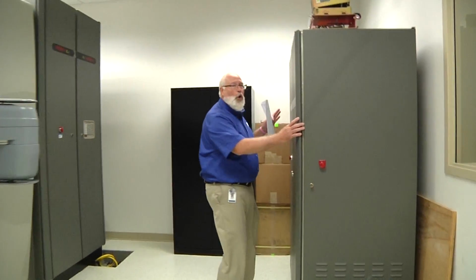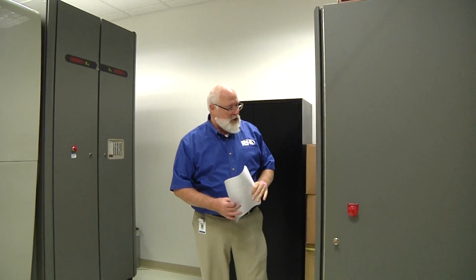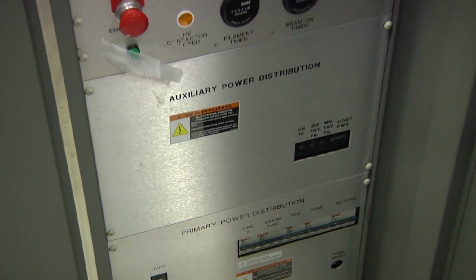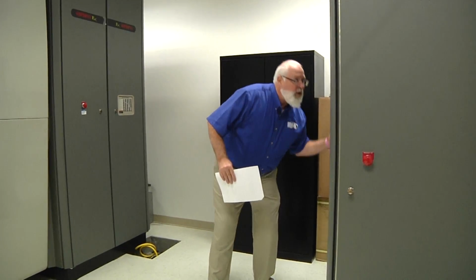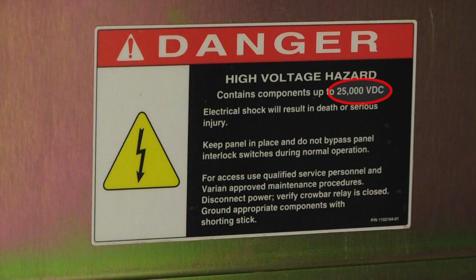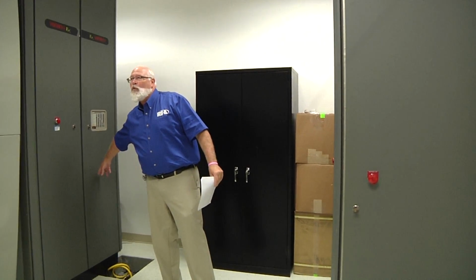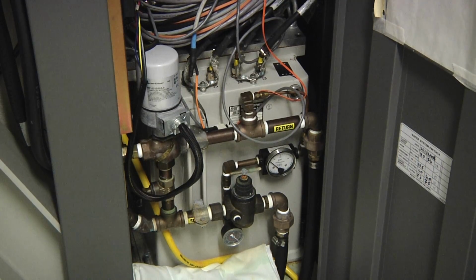So this is an older modulator. It's what we call the tall one. Down here at the bottom, this is your 120 volts or your 208 volts to get everything working. Over here and on top, this is everything that produces your high voltage to run your klystron. This is about 25,000 volts coming off. It hits a pulse transformer in the bottom of this. So when you're treating the machine, you hear the bzzz. That's that pulse transformer at the bottom.